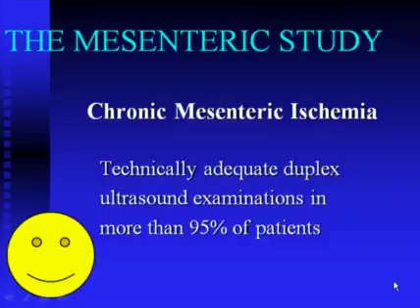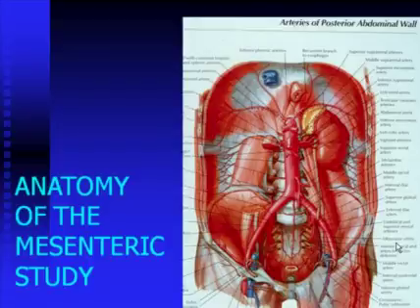There will be that small fraction of patients who, for whatever reason, still have extensive bowel gas, which you just cannot penetrate. You're going to know this early on in the course of a study. You do not need to do any more than that. Just say, we'll try, send them home, we'll try it again at a later date. But that's an extremely small percentage of the patients you're going to evaluate for this problem.